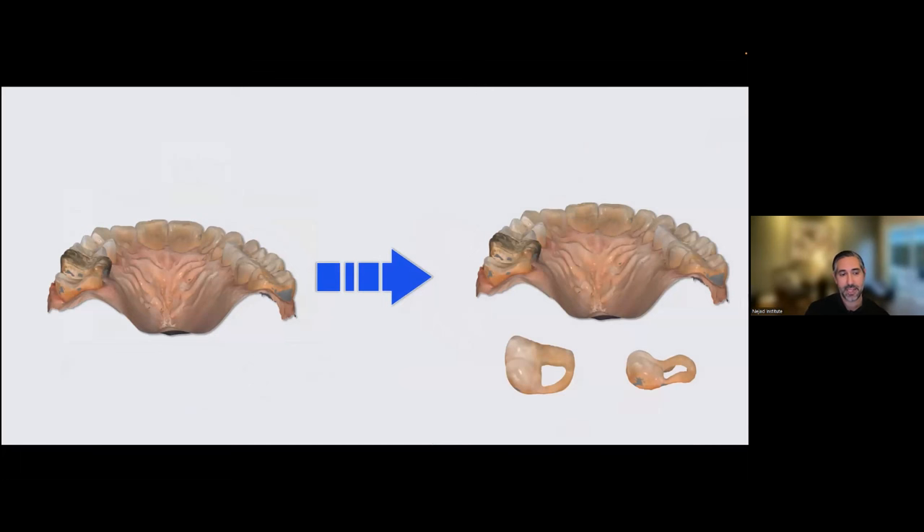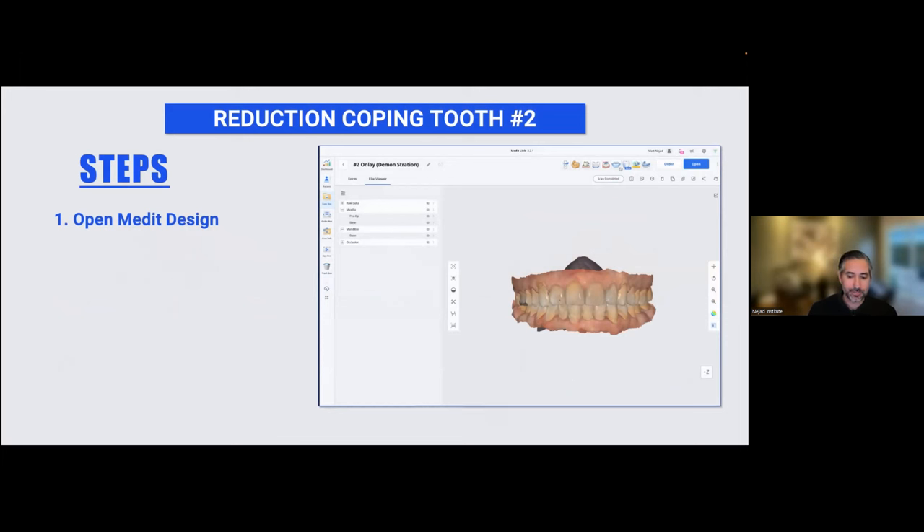We need to take the scan that is under-reduced on that distal lingual, make a new scan and a reduction coping. The new scan goes into my design software for my mill, and the reduction coping will be used in the mouth at the delivery appointment. It would be super cool if we eventually have the ability to make this an automated workflow or app — maybe something in Medit Clinic CAD — that creates both the coping and the scan adjustment so you can produce a restoration, whether 3D printed or milled. I'm going to take you step by step through this because Medit Design is very advanced but very simple once you get the hang of it. The future of dentistry is all about these digital techniques.